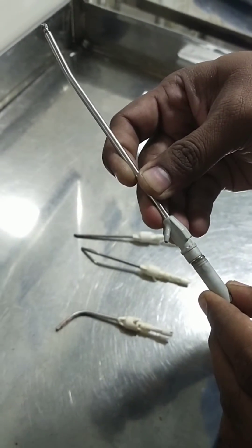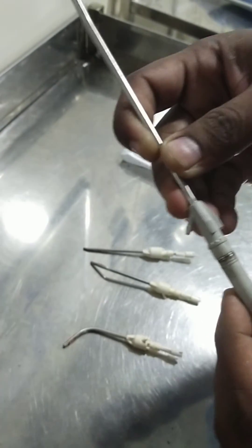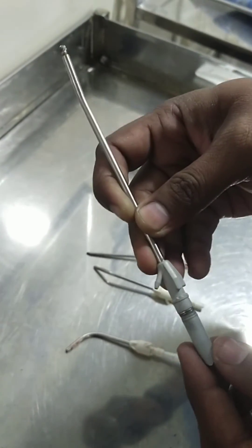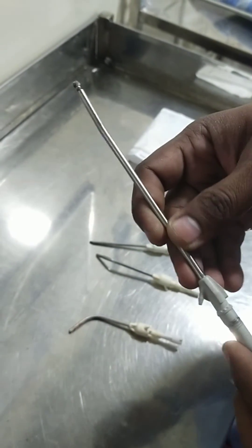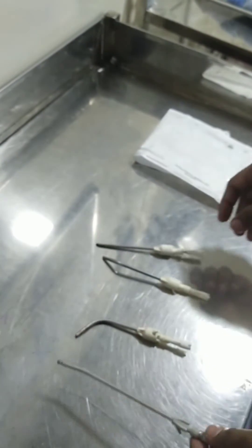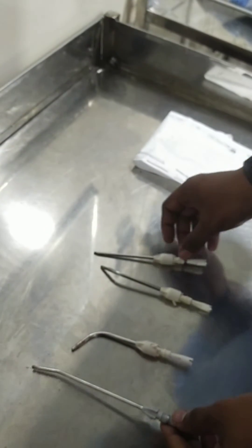What happens ultimately is the motor will try to rotate when you press the foot switch, and this will damage the motor windings. So don't re-use those blades and burs, so that we can increase the handpiece life. Thank you.